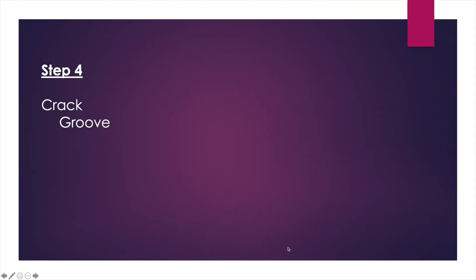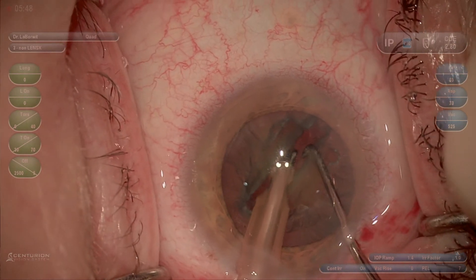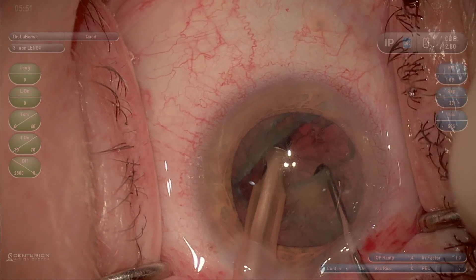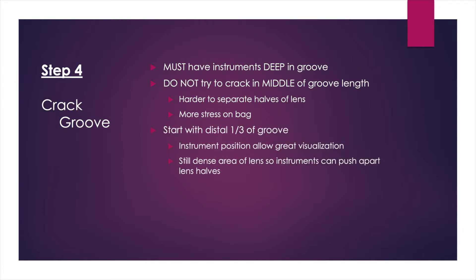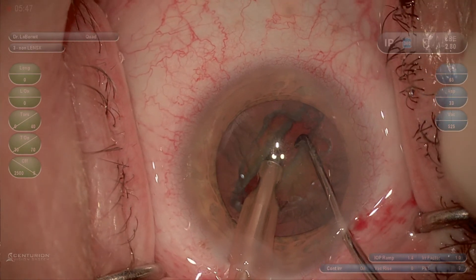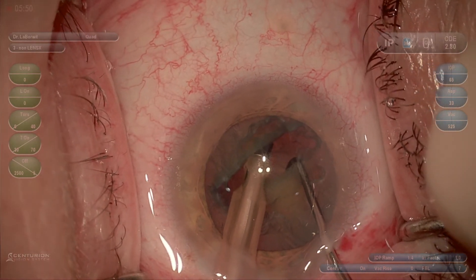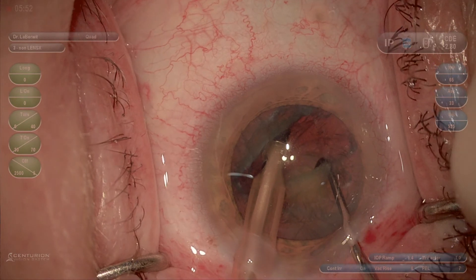The fourth step is to crack within your groove. You need to be as deep as possible in the groove to have firm material and easily separate, so really work to get those instruments deep. Rather than cracking in the middle of your groove—which is harder to separate and puts more stress on the bag—go to the distal third of the groove. This gives you better visualization of your instruments and allows you to visualize the crack more easily. Also notice that as you separate in this area, you're more twisting the two halves, so there's less stress on the bag as well.